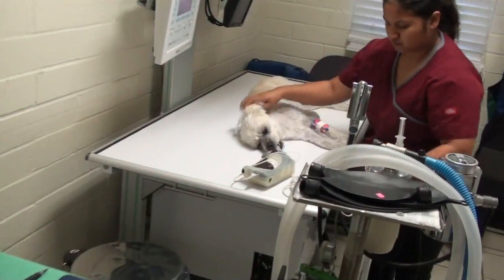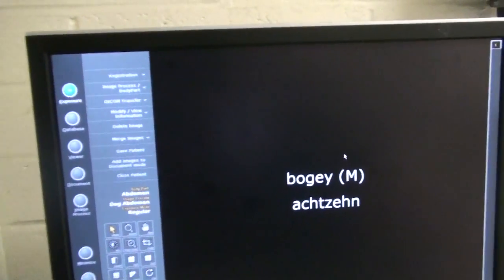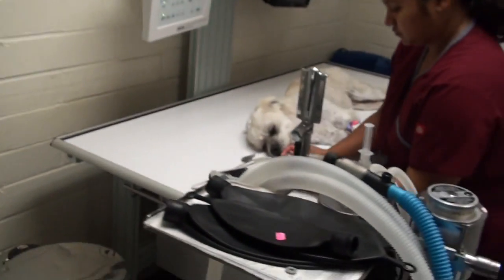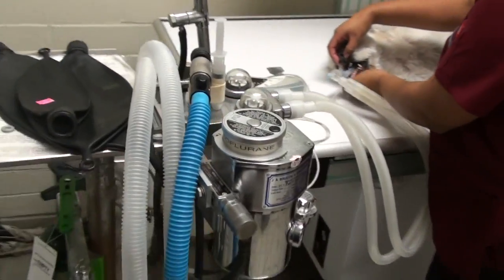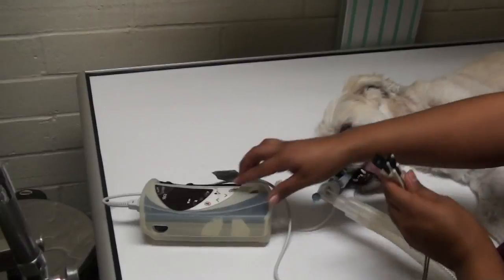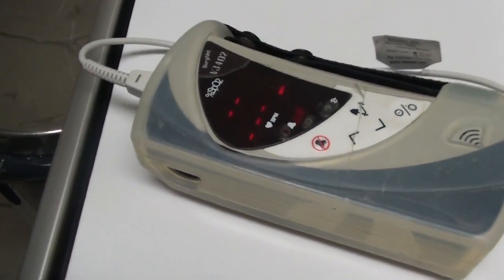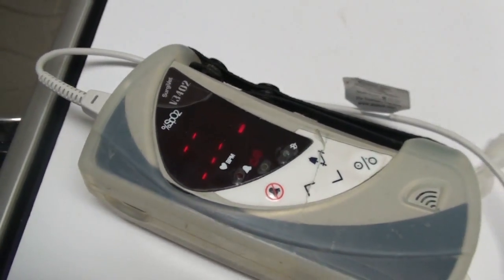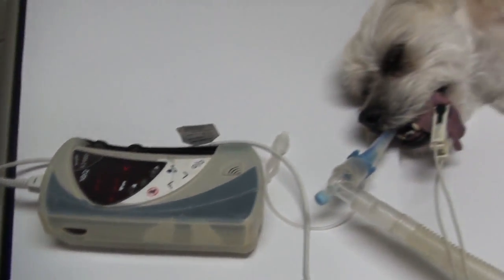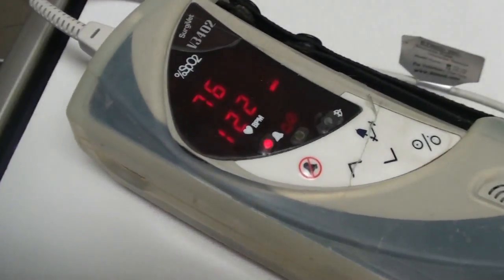We're bringing Bogey in to take x-rays, make sure to see what the stones look like now. There's his name on our digital x-ray machine, and here's our anesthetic machine in our radiology area. Isabel's making sure that Bogey is doing well by putting a pulse oximeter on his tongue, and the machine's waiting to measure how much oxygen is going through his body and how fast his heartbeat is.